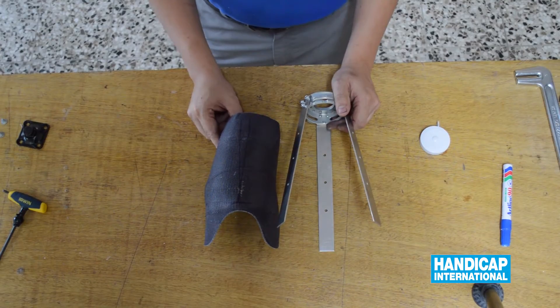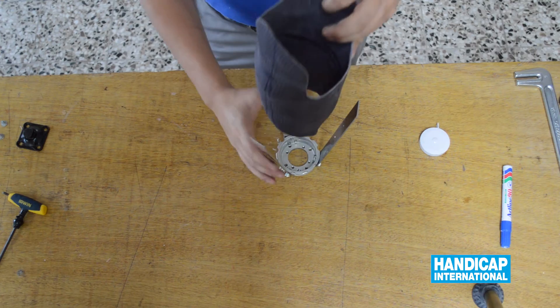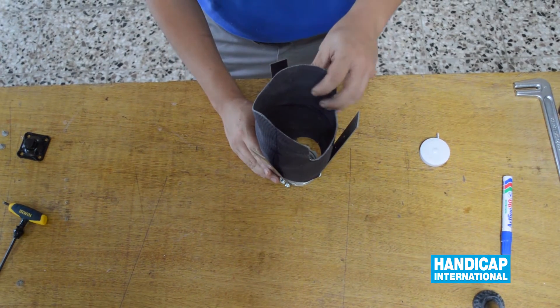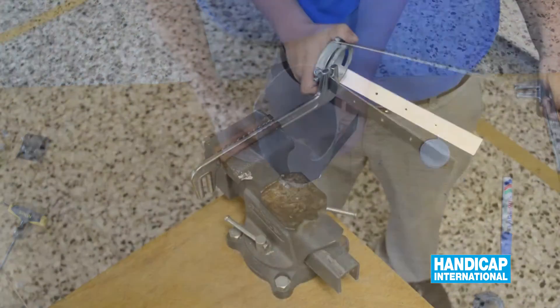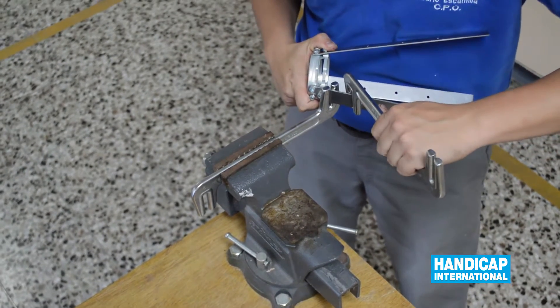We place the socket into the base of the prosthesis, making sure that we do not harm the stone. Proceed with the adaptation of the sidebars to the socket.